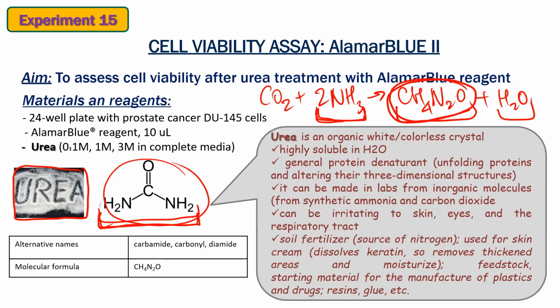Okay, so it exists in the lab as a powder. Of course, first you need to calculate the molar concentrations, and you need to dissolve it. And of course, it does not matter what you use because it's highly soluble in water. So you could use water or you could use DMEM. And in our case, we're going to use DMEM because our cells will be living for 24 hours in such an environment. And of course, they still need albumins, they need growth factors, etc., etc.